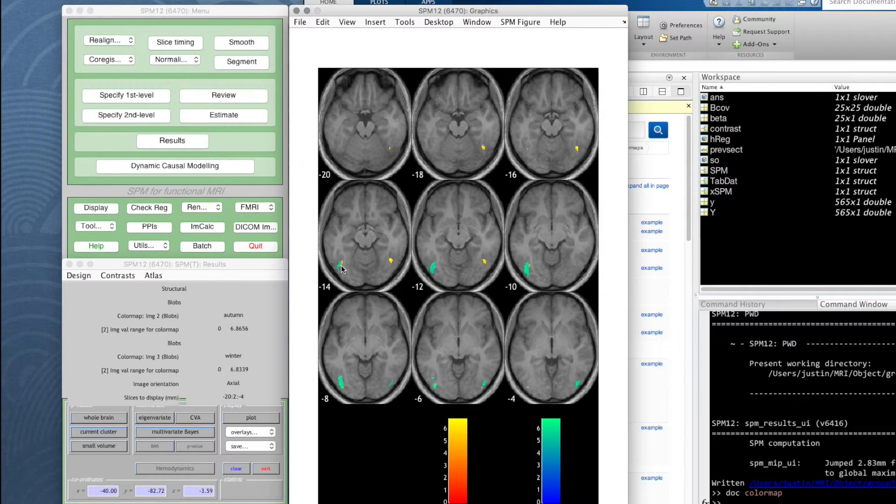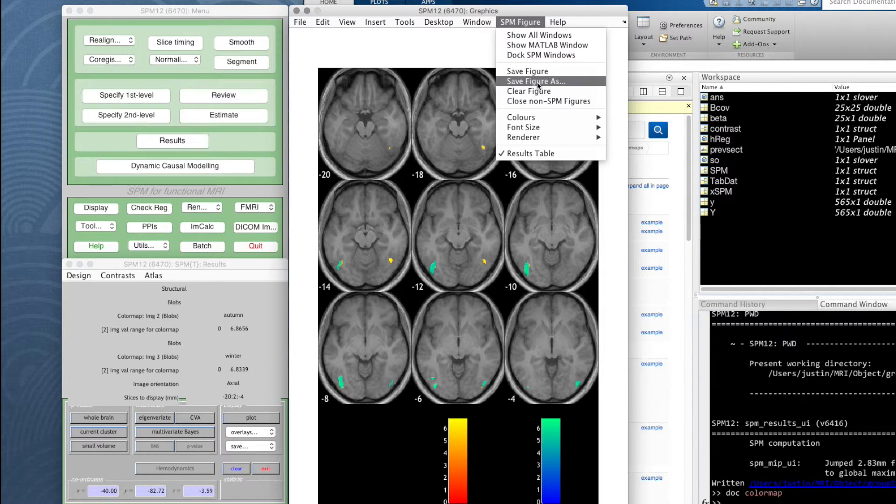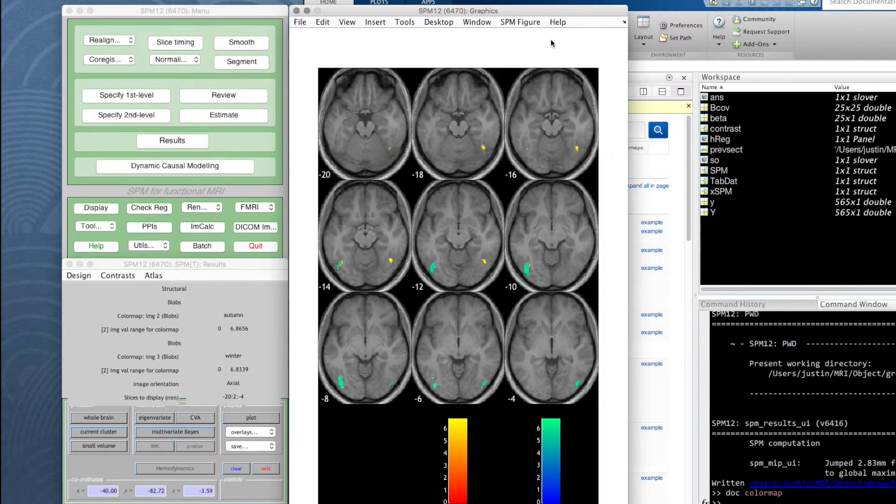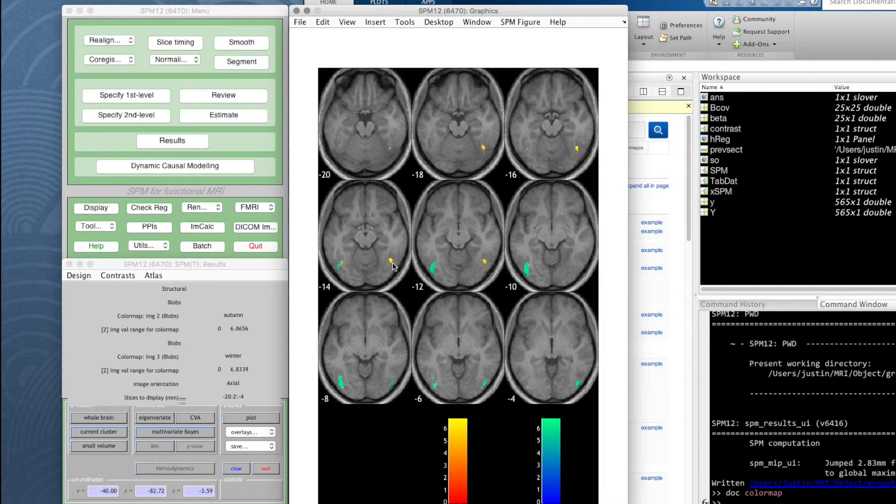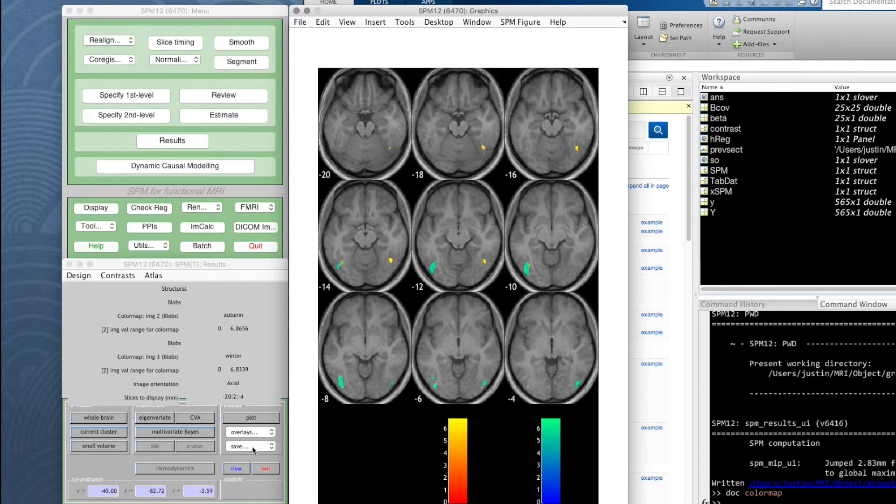This can happen. So this figure, because we've carefully chosen the slices to display, you might want to use all of that. And again you could just do save figure as, save it as an image file and pop it into a word processing document and then label it properly. Because this as it stands doesn't tell us what the contrasts are, it doesn't tell us what the p threshold is or the correction, multiple comparisons correction, or the extent, or what this scale means. It's actually t values, so you'd have to put all of that in.